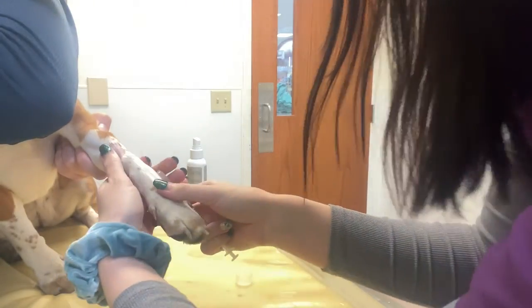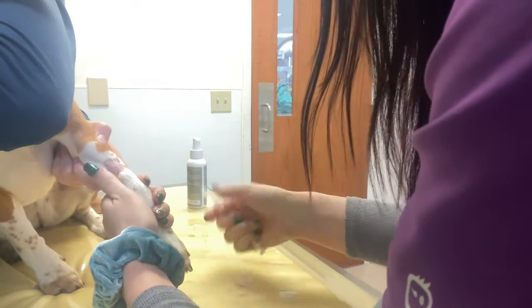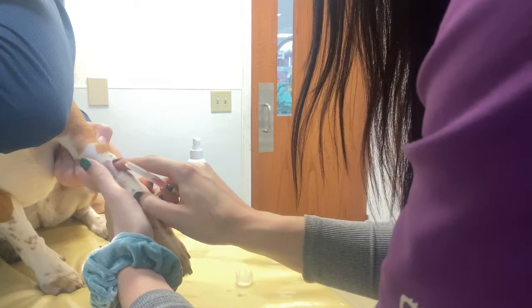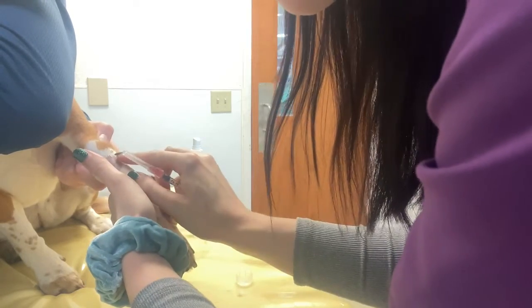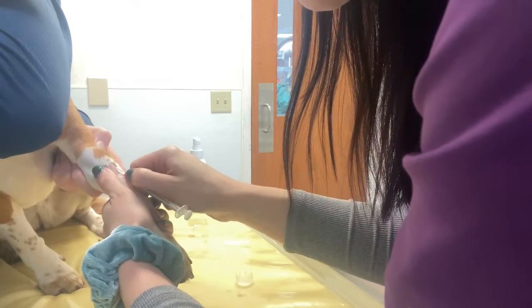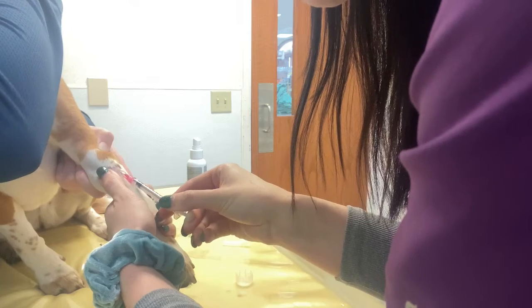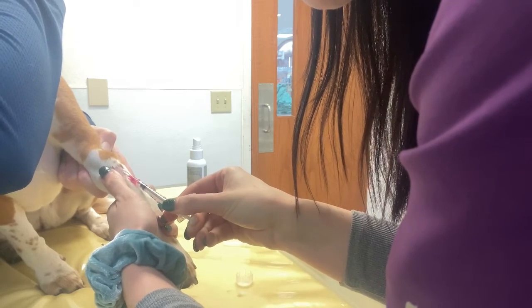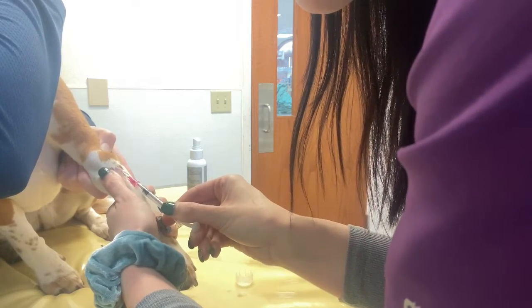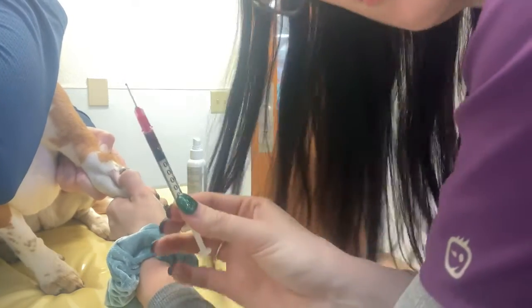And then since she doesn't actually need any blood work done, it's just a small TB syringe. Good girl, Zoe. And there's our blood.